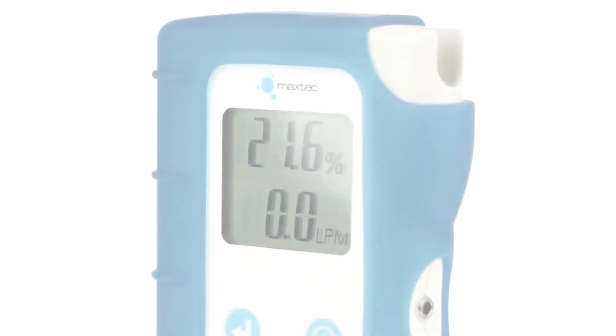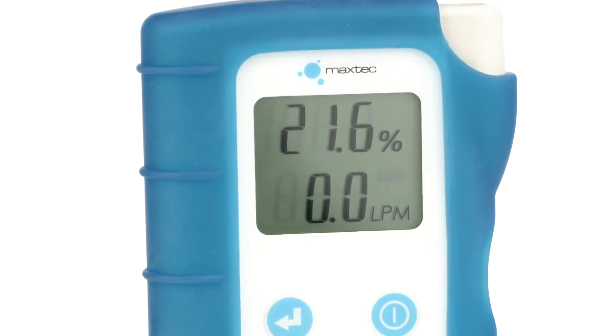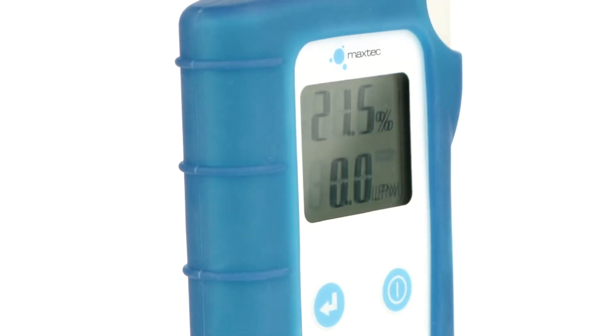All in a single device that fits in the palm of your hand. The compact design and clear LCD display make concentrator performance checks quick and easy.